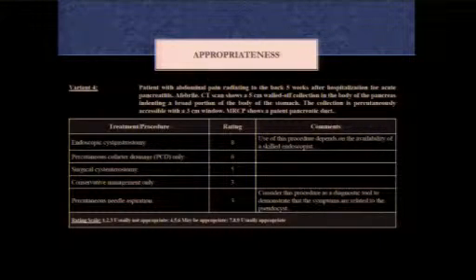as obstruction. They also talk about, in the case of if you have a peripancreatic abscess or infected pancreatic necrosis, sometimes necrosectomy, percutaneous necrosectomy is indicated in the States at least. So that would be percutaneous placement of a catheter into the infected collection, trying to drain it. And sometimes they can put 2 catheters in that infected pancreatic tissue and basically try and irrigate through one catheter and drain through the other to remove that necrotic tissue.